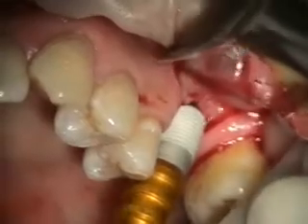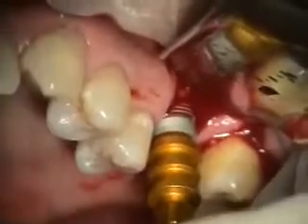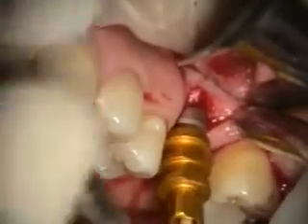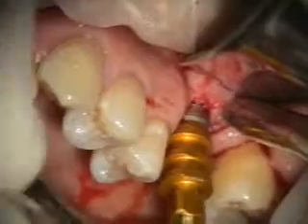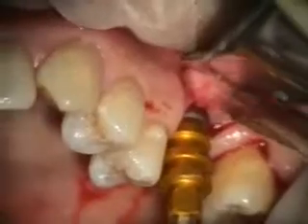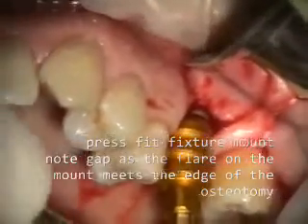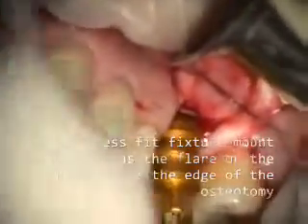We're placing a 5.7x10 Implant Direct fixture. This has a 5.7mm restorative interface and a 5.7mm diameter implant body, as opposed to the Zimmer, which is a 5.7mm restorative and a 6.0mm implant body — which I'm finding is much harder to place because it binds more. So I'll switch to Implant Direct because it's more predictable.